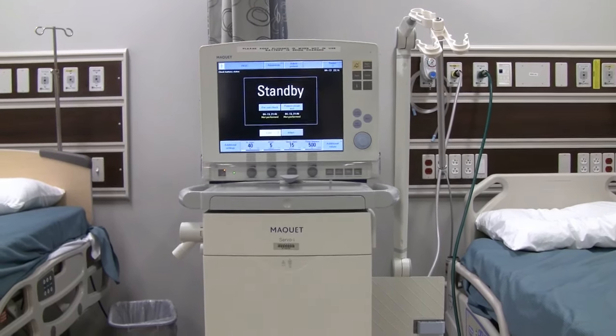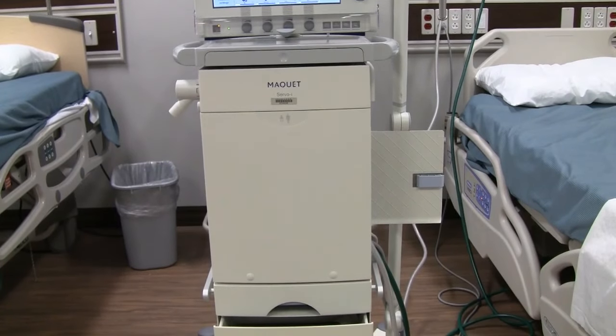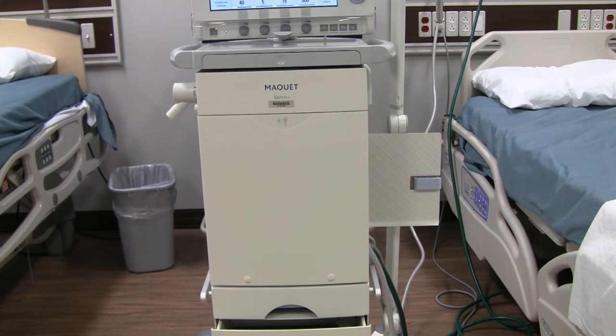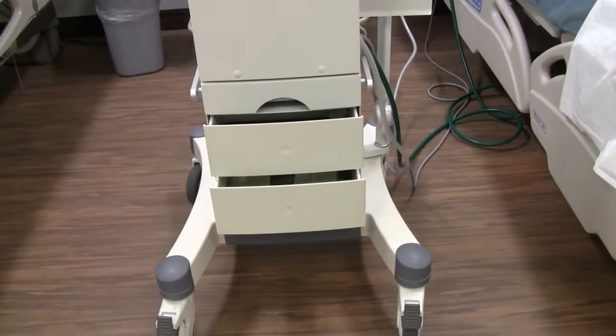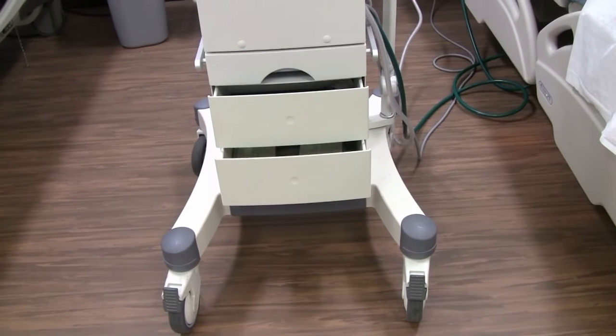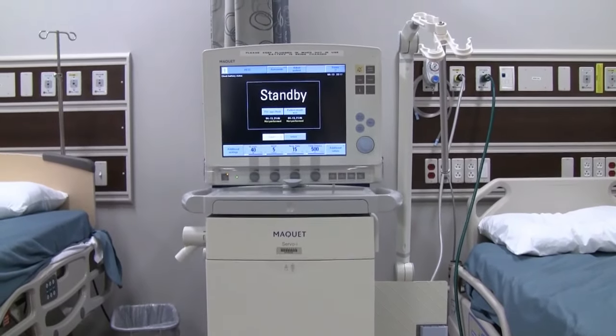Below that you have your patient unit — the lower box — which is the part of the vent where gases are mixed and administered to your patient. We currently have this ventilator set up on the mobile cart it comes with. It carries all your accessories and makes it easy to position the system on the right or left of the patient, and it has a couple of drawers at the bottom for supplies.